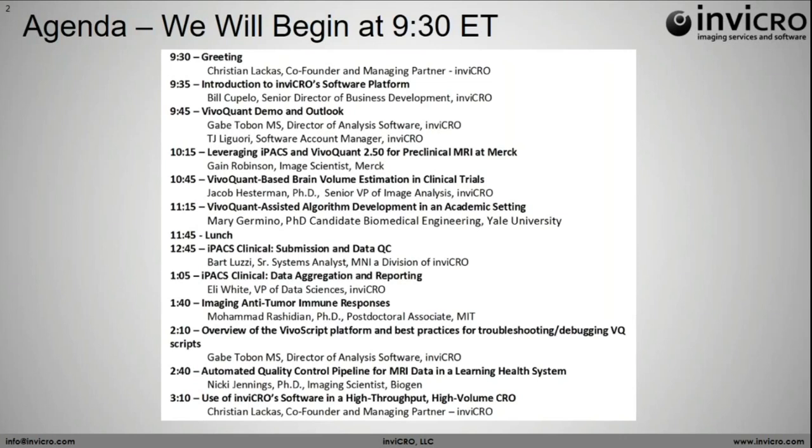Yeah. Thanks, Gabe. So building off of Gabe's presentation, I'm just going to quickly go through a live demonstration of some VivoQuant tools.